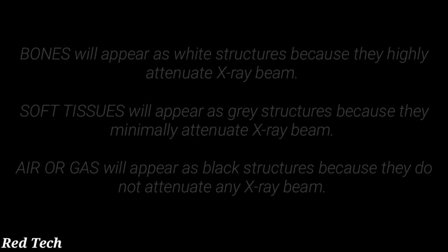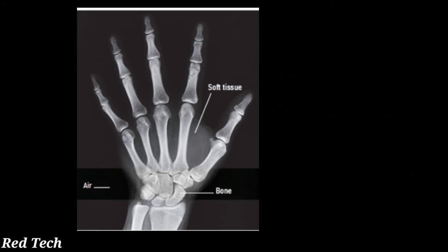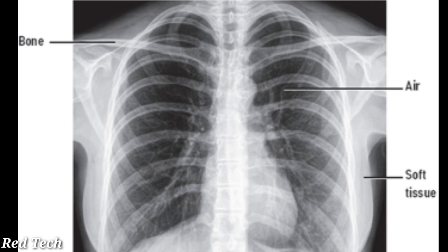Now look at this radiographic image — this is a hand AP x-ray showing soft tissue, air, and bone. You can see that soft tissue appears gray, air appears black, and bone appears white in the radiographic image.